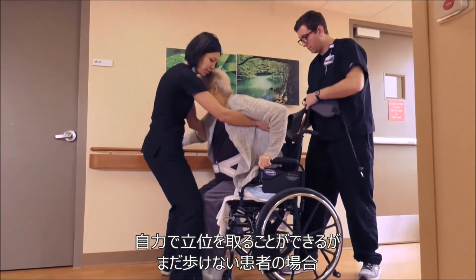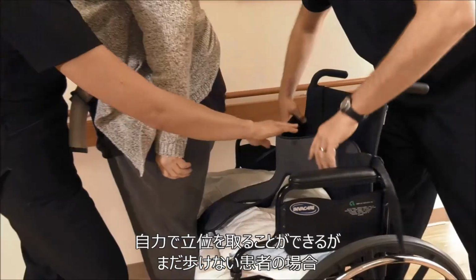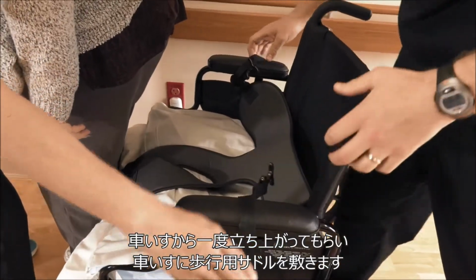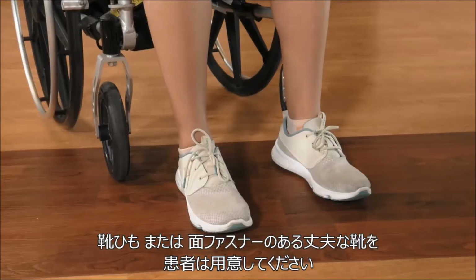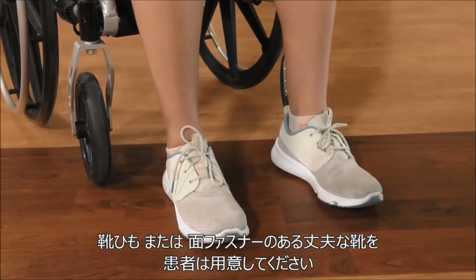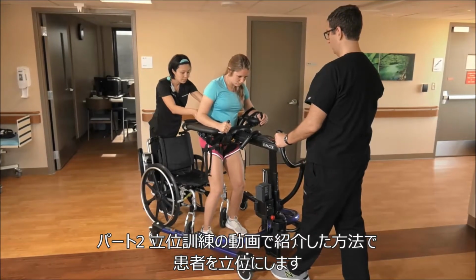If a patient has the ability to stand but not walk, have them stand from their wheelchair while an assistant places the pelvic support on the wheelchair. At this point, it is best to move to a quiet hallway that is clear of obstacles. Make sure that the patient is wearing sturdy shoes with laces or Velcro straps. Stand the patient up, as shown in the previous video.